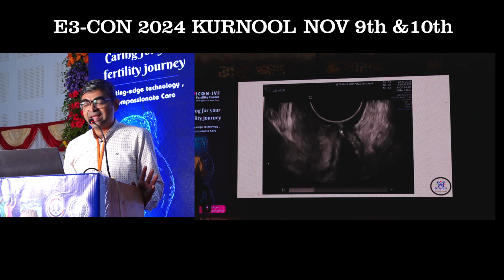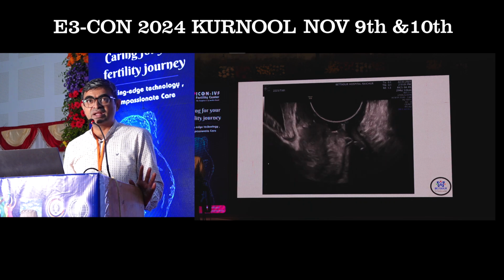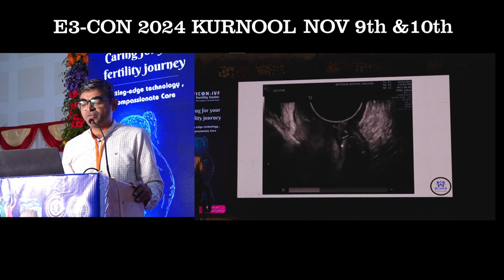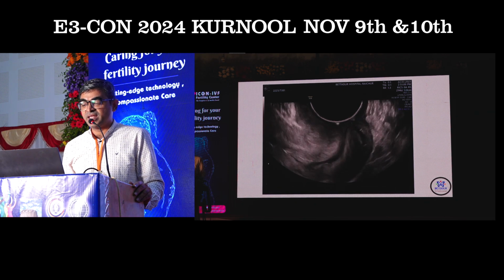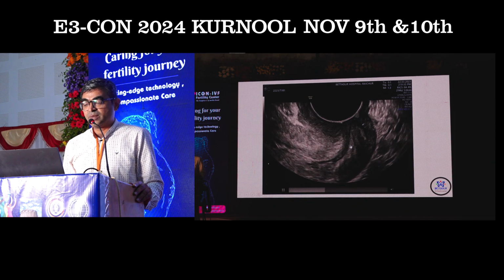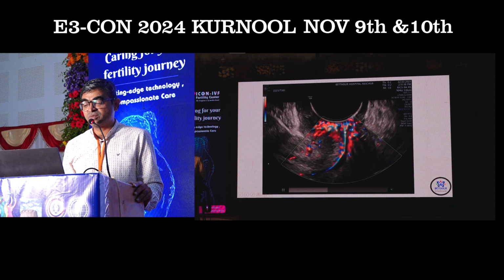See, in gynec, I always say you don't have any principles like the ALARA principle. If the fetus or embryo is there, you just put color. Always play with color. Color will give you a lot of information. For example, if I put color on this, you are able to appreciate that the stalk-like lesion has vascularity like a single pedicle, which is almost coming from the corpus. It's not from the cervix.